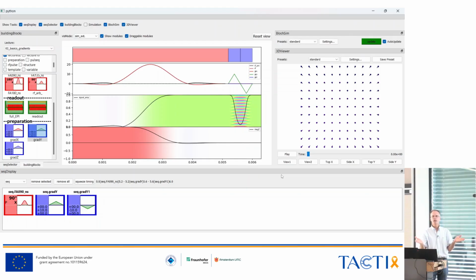And that's what we would call a gradient echo. Yeah, so we are first dephasing our spins, and then we are starting to rephase them. And the area between those two gradient pulses, the sum of the areas, is 0, then everything will be realigned again.